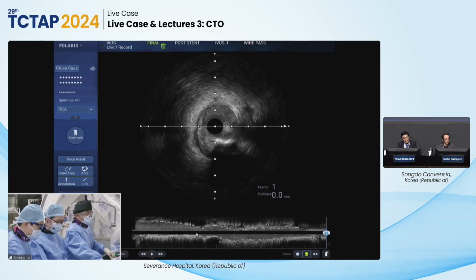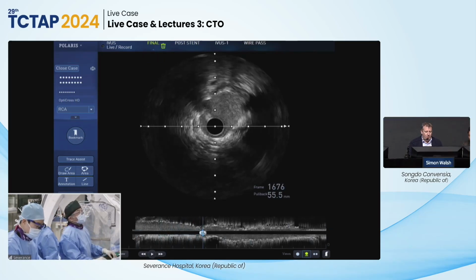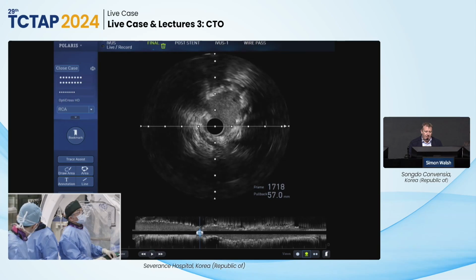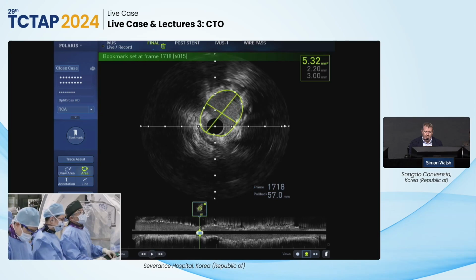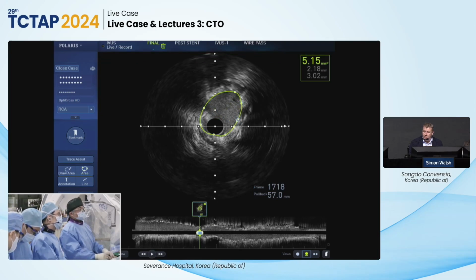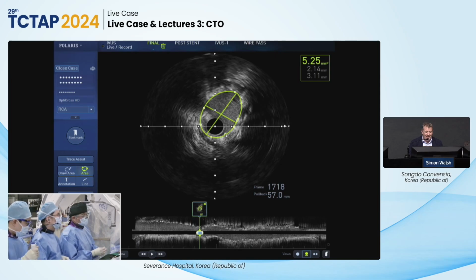And I don't know if it's an option in every country, but the OPN balloon can sometimes resolve these sorts of segments. But again, you don't upsize it. One thing with OPN, just to be wary of if you are using them, is that with dual core wires, at very high pressure, it can grip onto the wire and pull it out. So sometimes worth putting down some old technology just for the OPN dilation.